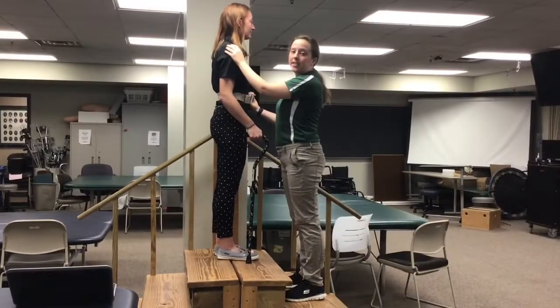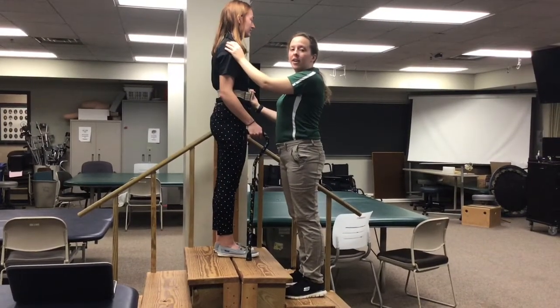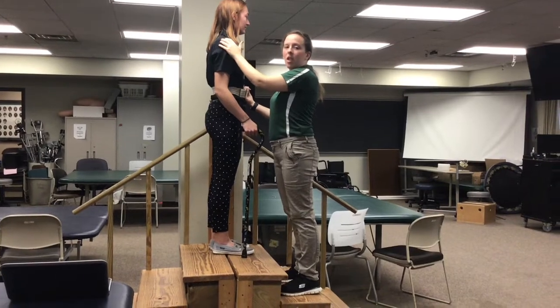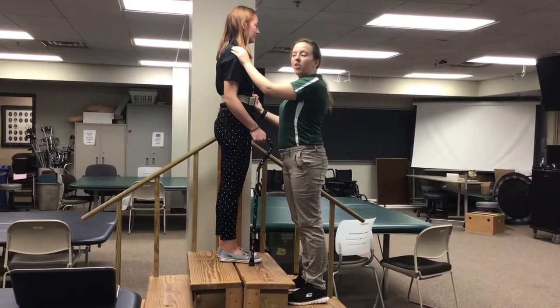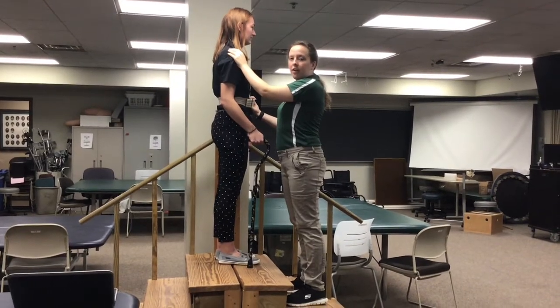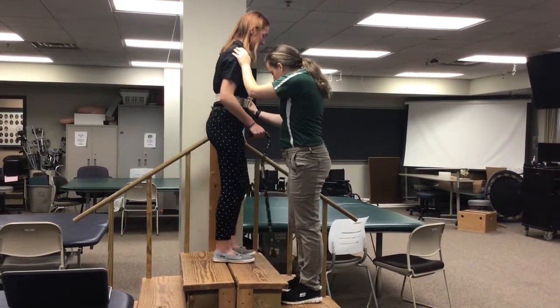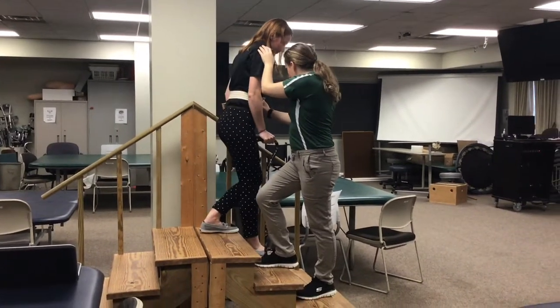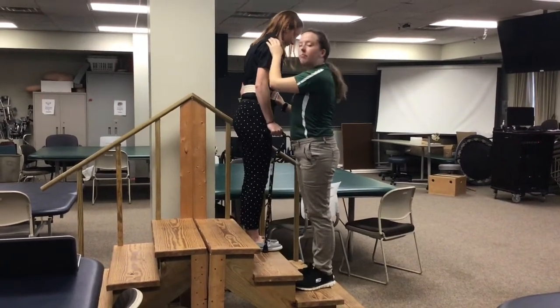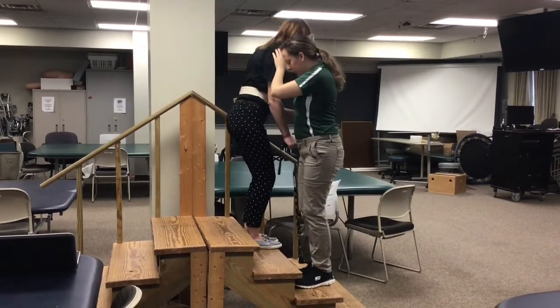Now we will cover how to descend stairs. You'll begin by standing in stride with your patient in front of them, with a hand on their shoulder and a supinated grip on their gait belt. Your patient will begin by placing their cane down on the next lowest step, so can you move your cane down? And then your involved extremity, and then your uninvolved extremity. Good. And now we will repeat this process.